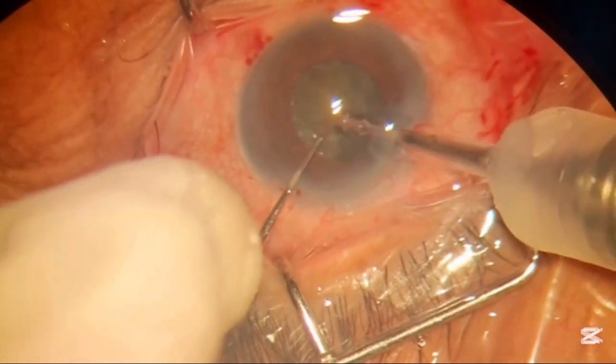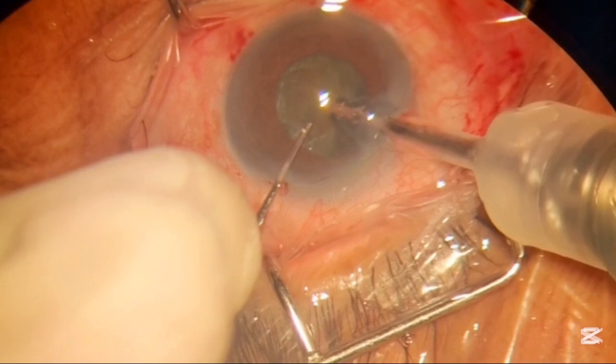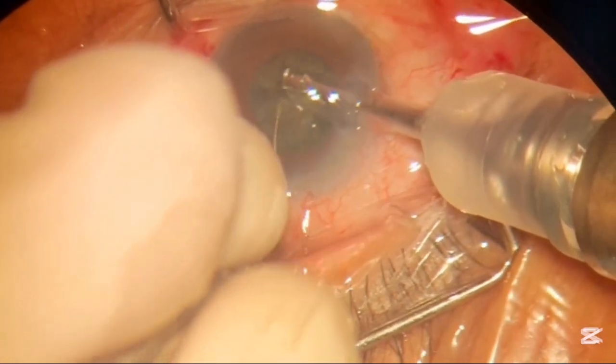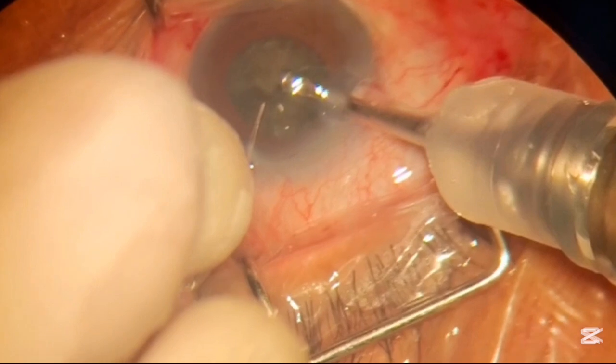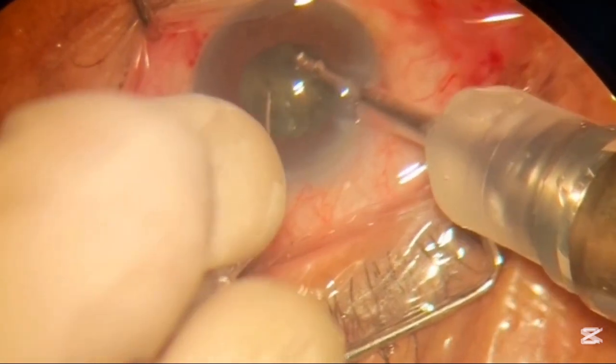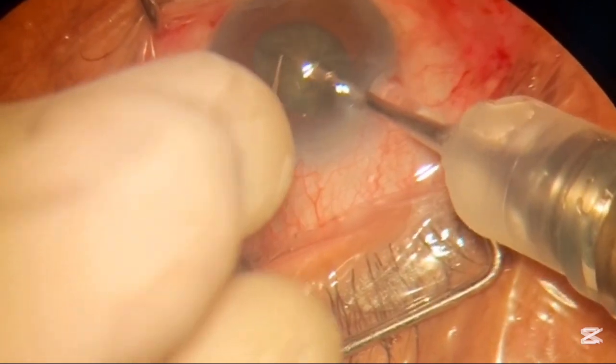Now we will make a small pit in the center of the nucleus so we can hold the nucleus and perform the first crack. Now you can see this is the crack and that is done. Now we will again hold the nucleus and perform the second crack.